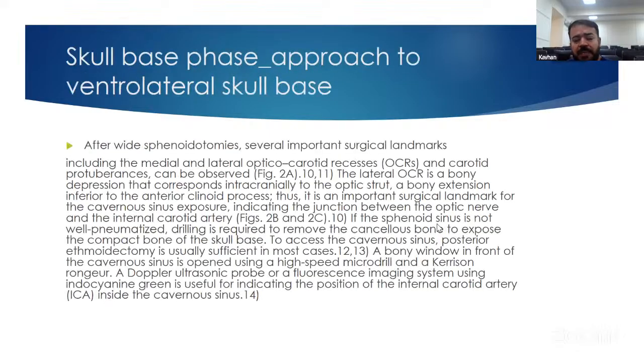So after that, we have the second portion. As I have told, the first is the nasal portion for the neurosurgeon, and the second is the skull base portion, which is the ventrolateral skull base approach. After a wide sphenoidotomy, there are several important surgical landmarks. I will show all the pictures in the next slide.